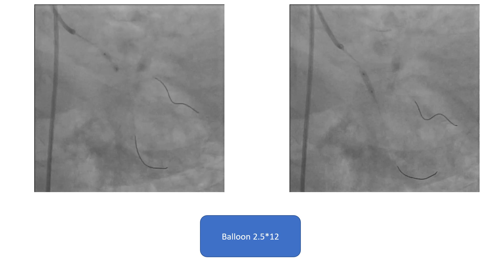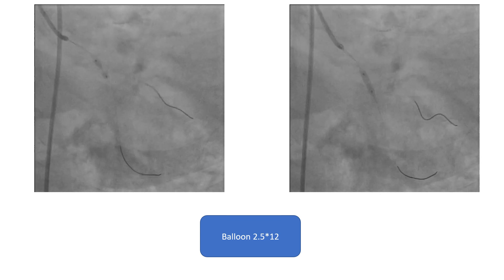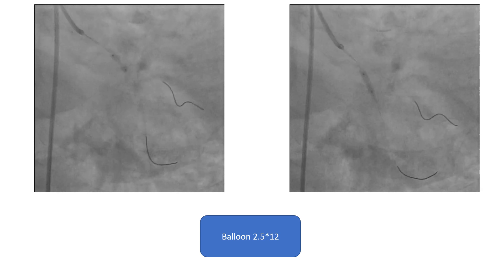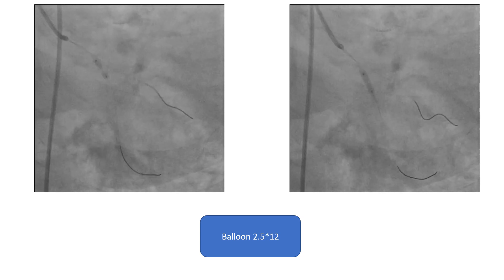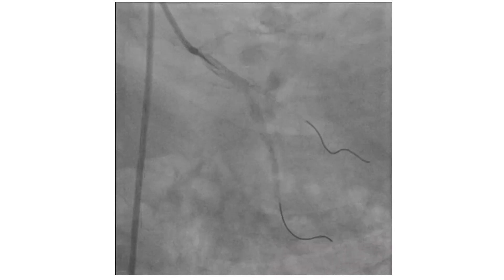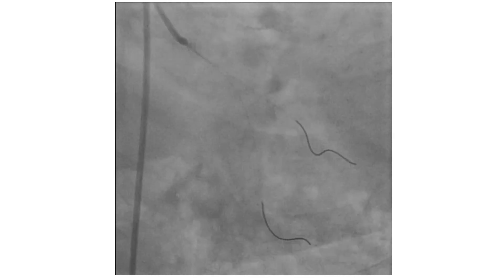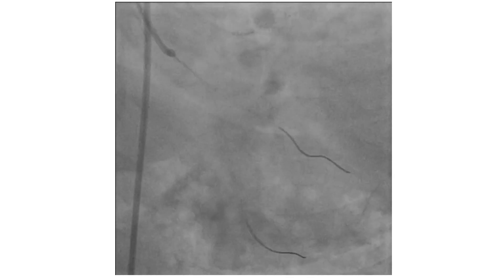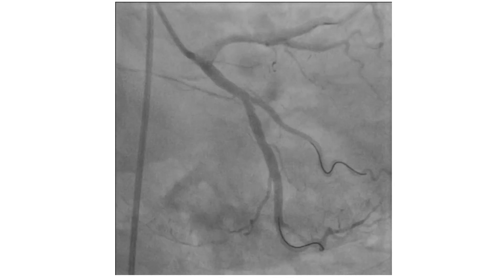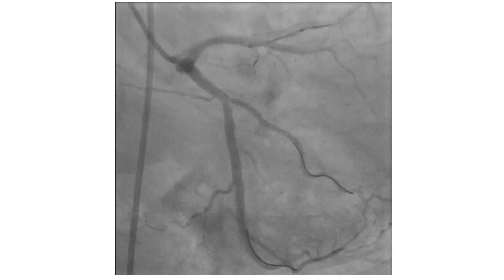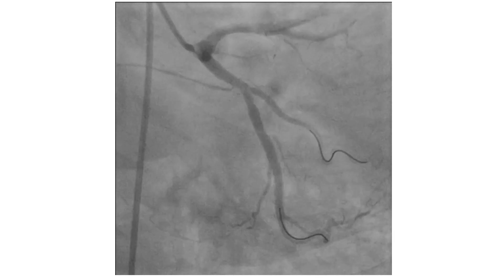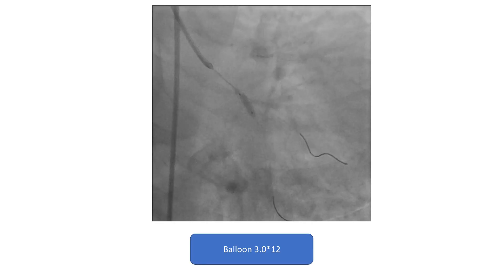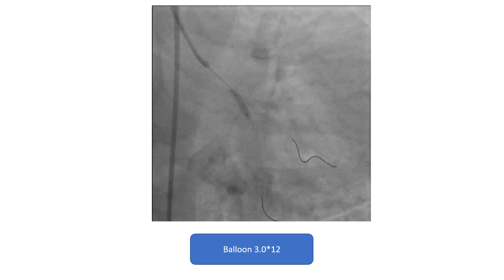So it was a straightforward case for provisional bifurcation strategy. Predilatation was done; the lesion was tight and higher pressure was needed. The result after predilatation was acceptable, but since the lesion was tight, we thought further preparation was needed, and so a larger balloon was used — an NC balloon 3 by 12.